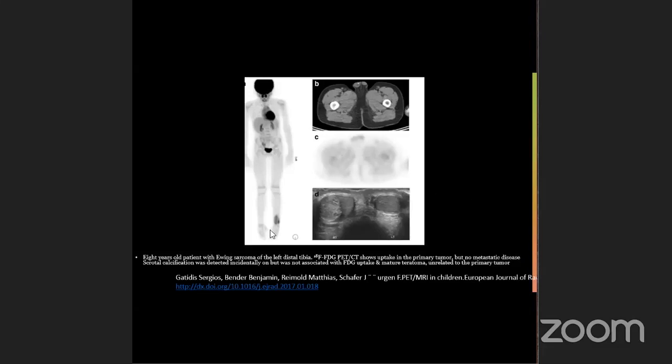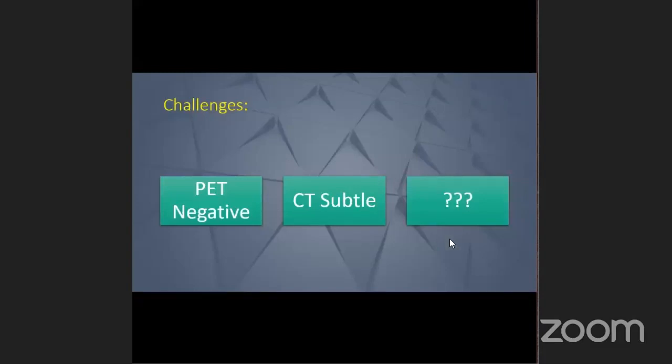So here, for example, this patient has Ewing sarcoma, as you see, and you know this by CT and X-ray and so on. After you get the detection, you note that there is calcification in the CT while you scroll through the axial images. So what will we do? We'll do ultrasound. Through the ultrasound, we find another incidental lesion, which this patient has: a teratoma. So not everything you see can be metastasis. It can be an incidental finding. Sometimes you can face thyroid nodules, renal cysts, bone islands. Not everything you see in the images is just metastatic lesions.